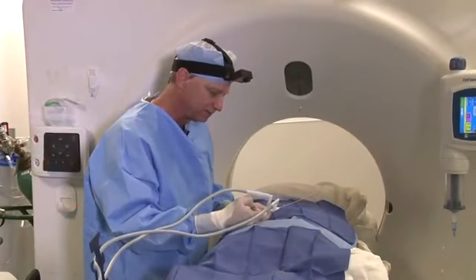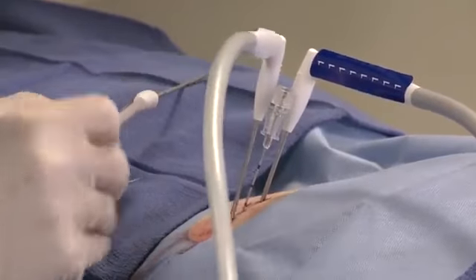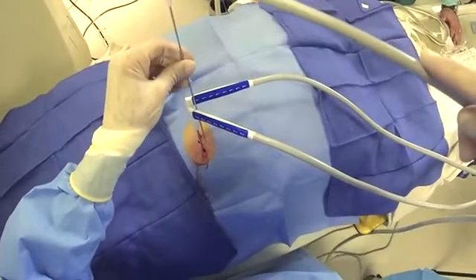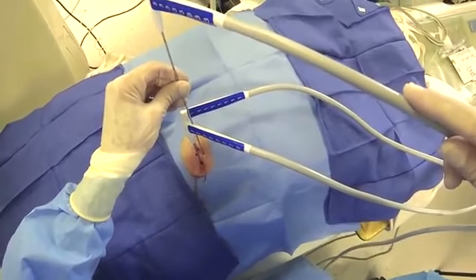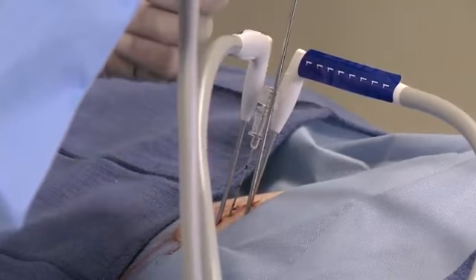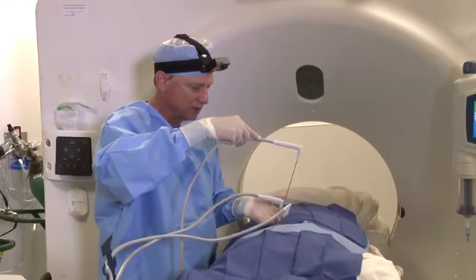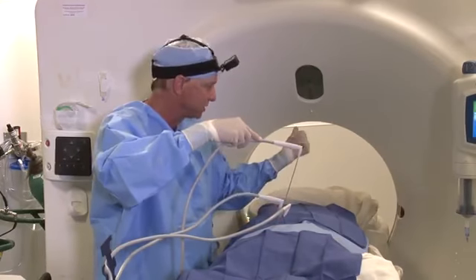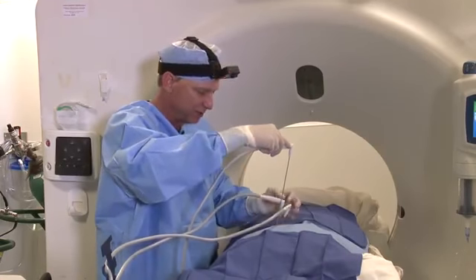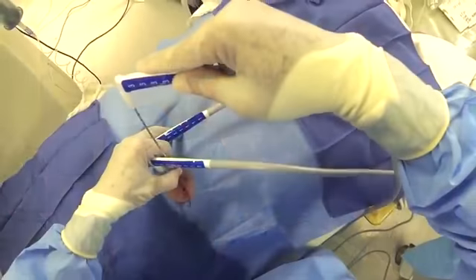Where our marking needle was, that turned out to be just the right spot. Again, you don't get too locked up in what you want and what is. You just make it what is, or what it needs to be. I'm going to go parallel to these probes because that's what's called for. You don't want to pull out your long probe early on, because you have to commit a lot of this probe just to get it in the gantry. So it's your 3rd and 4th probes that typically is called for.